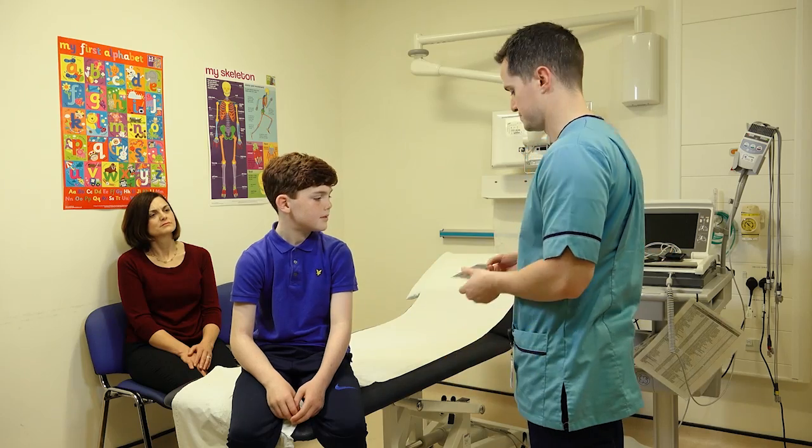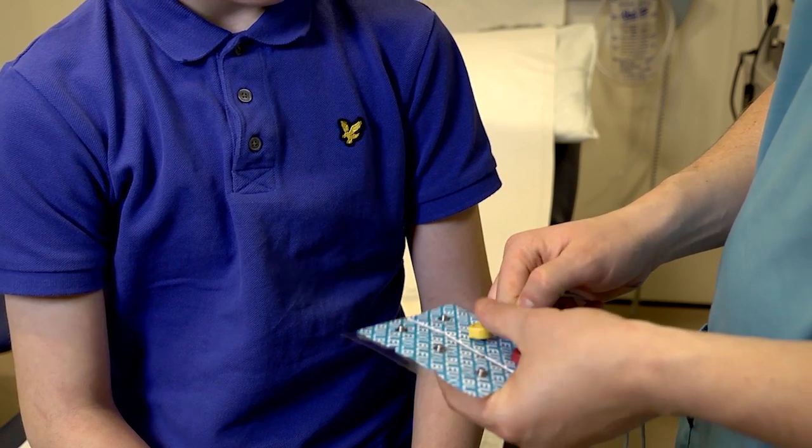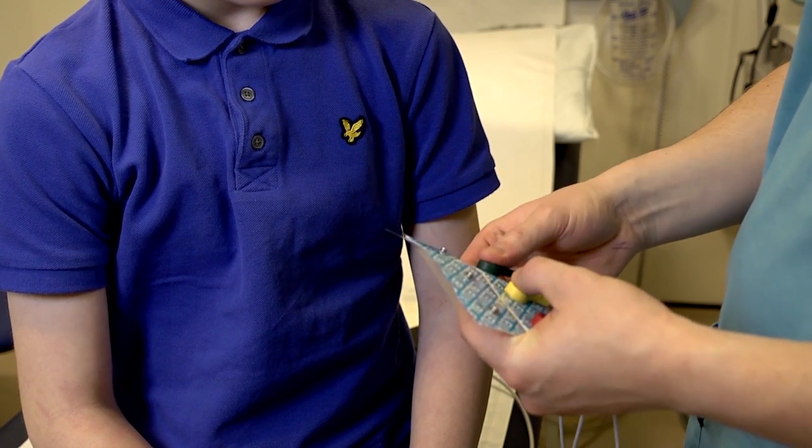Is it going to hurt? No Sam, not at all. All I'm going to do is attach these electrodes to you. There's going to be three electrodes — you can see the different colours — which means they go to different areas on the chest.